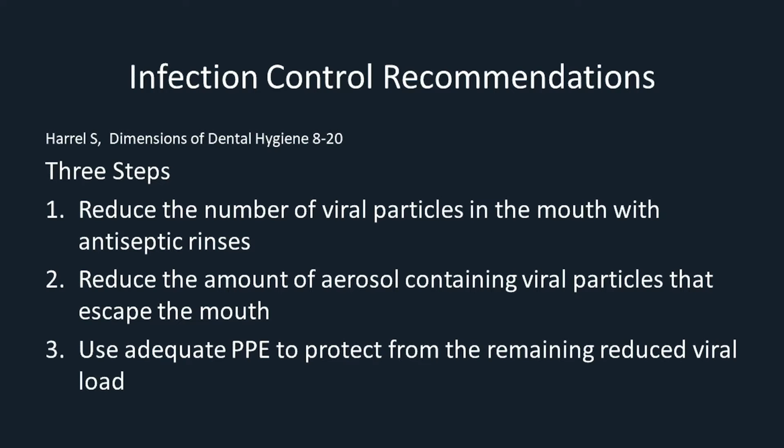I recommend a 3-step procedure, and this was published in Dimensions of Dental Hygiene in August of 2020. Step 1, reduce the number of viral particles in the mouth with antiseptic rinses. Step 2, reduce the amount of aerosols containing viral particles that escape the mouth. And step 3, use adequate protective equipment to protect you from the small amount of viral particles that may remain. So let's go through each of these steps.